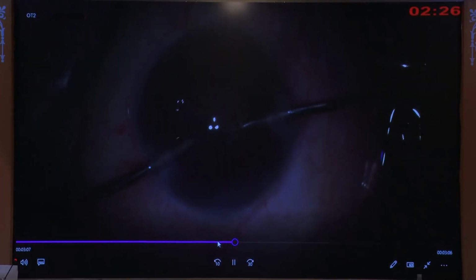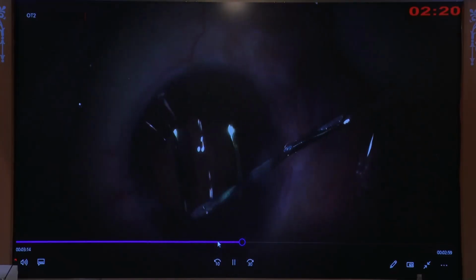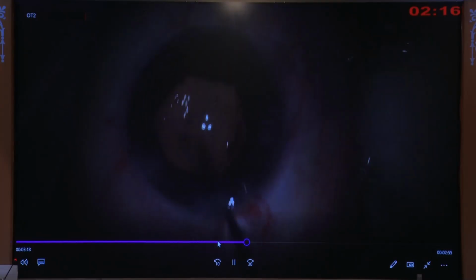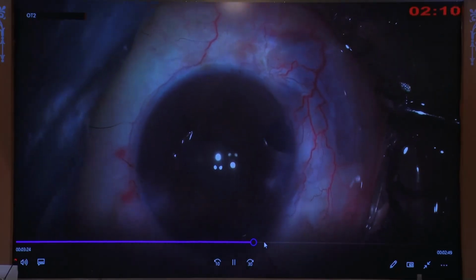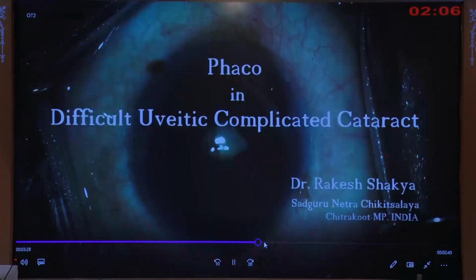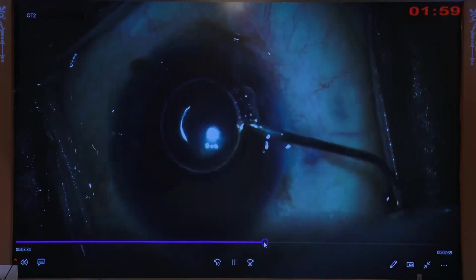And this case was post trabeculectomy and a bleb was there. After putting the lens, you always put some amount of visco under the iris and then remove the rings. Even the floppy pupil is also distorted. This case is very complicated, and this membrane was there.